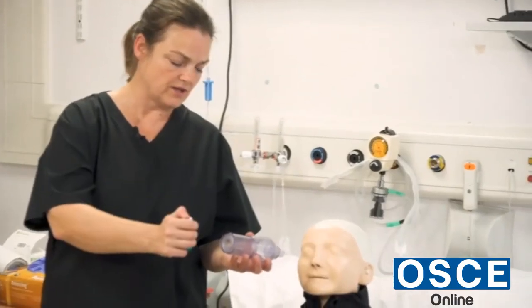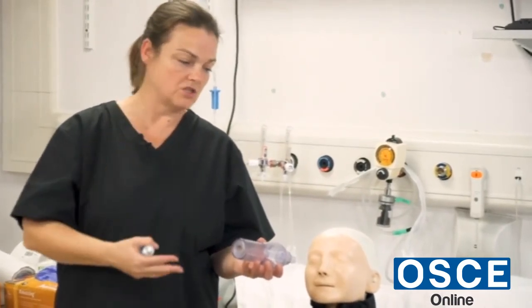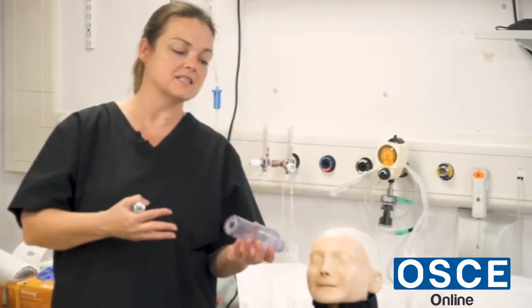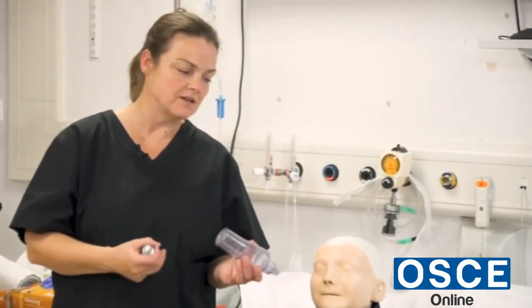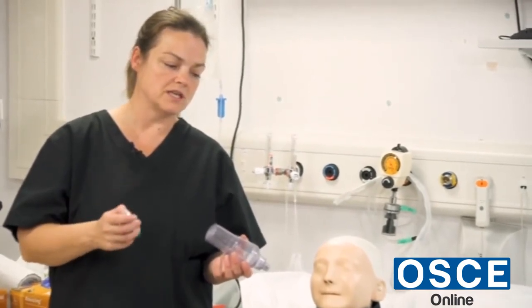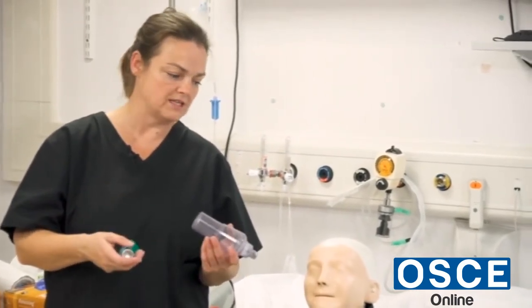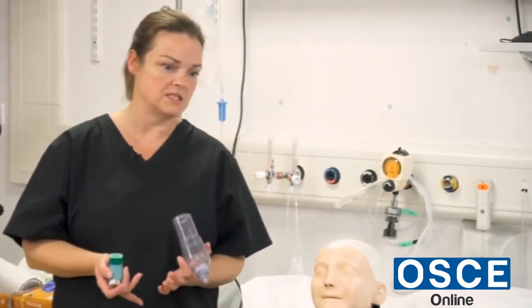I'm going to press down on the canister, and I'd like you to breathe in slowly over 2 to 3 seconds with your head tilted slightly back, and then I want you to hold it for 10 seconds and breathe out through pursed lips. You're having 2 measured doses, so we'll repeat that twice, but I will give you a rest for about 20 to 30 seconds in between, or longer if you needed it.